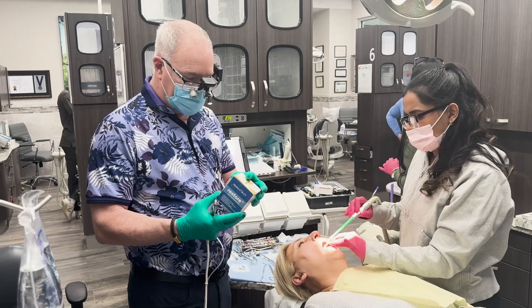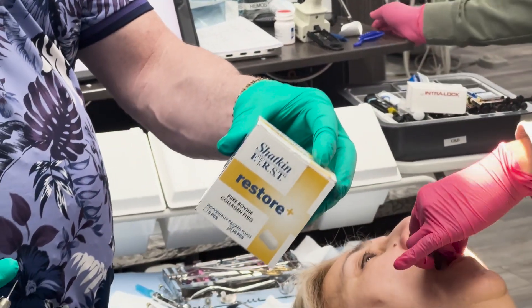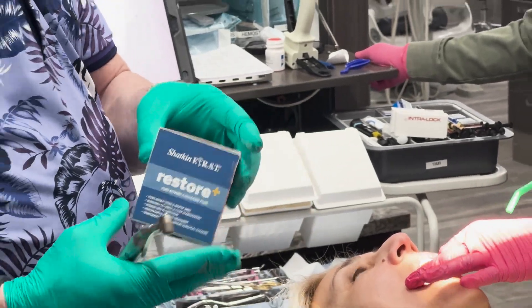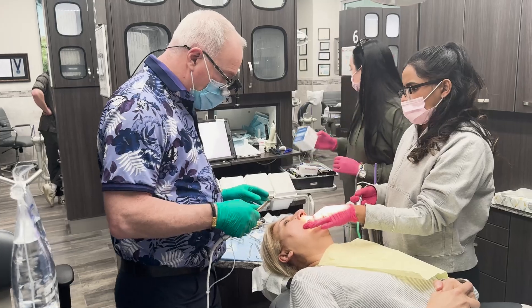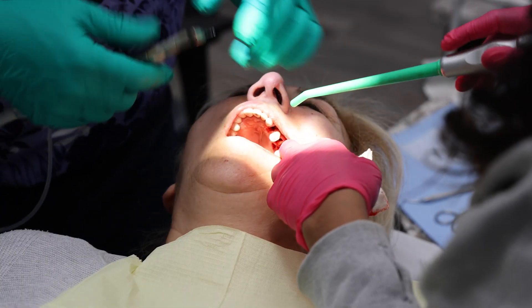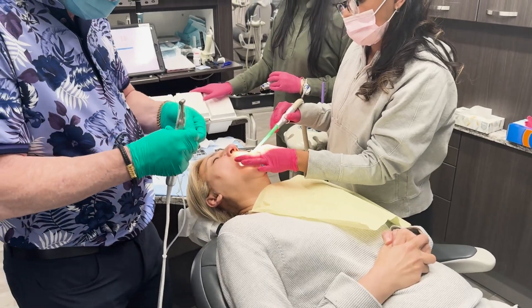We're going to be packing the sockets with the Restore Plus bovine collagen plug from Shatkin First. We're going to go ahead and make our pilot hole. You'll notice I'm using the drill extender.